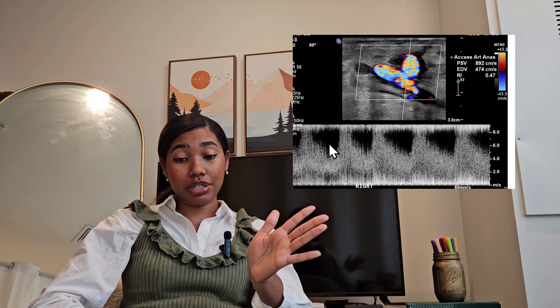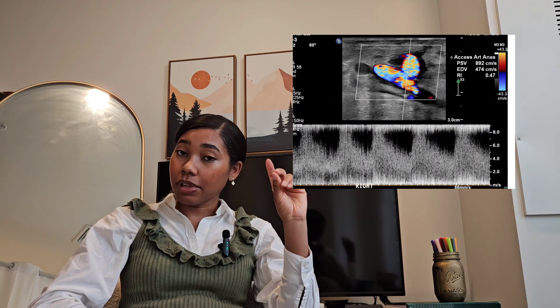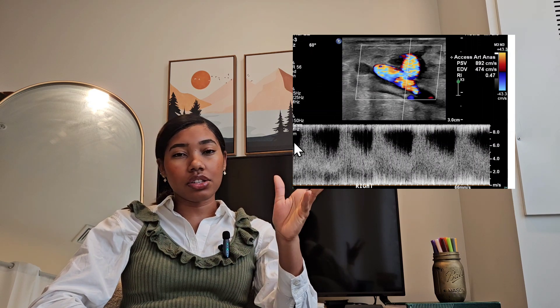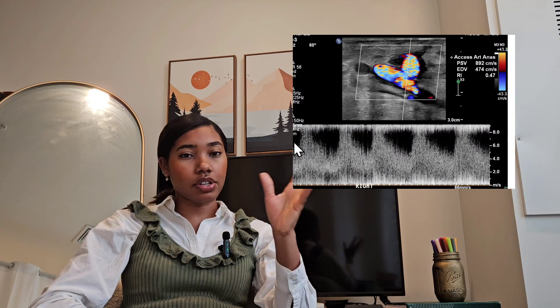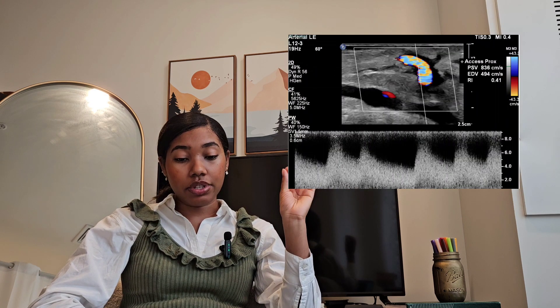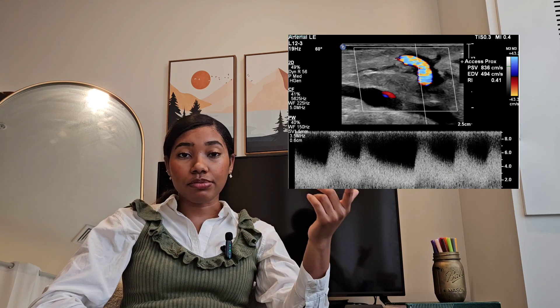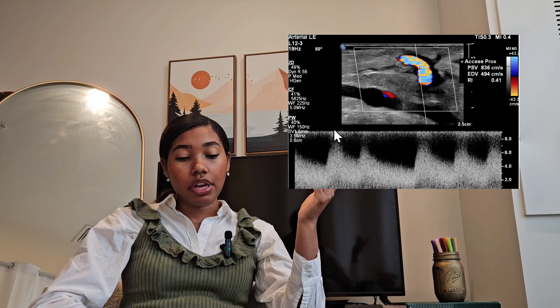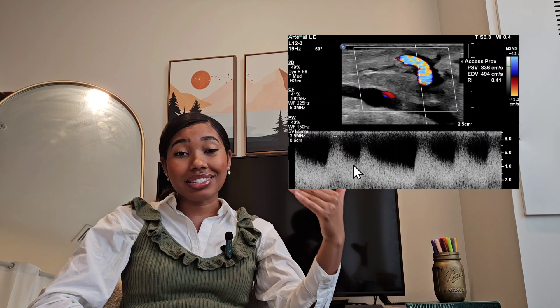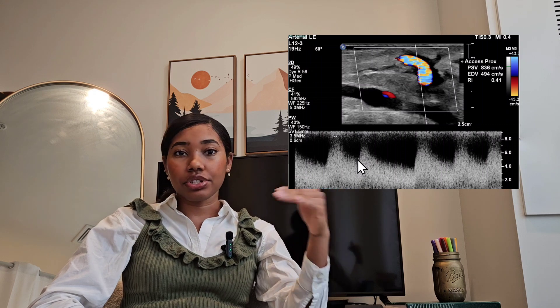As far as your color Doppler image, it's going to look crazy. You do have to play with the scale and color gain, but it's not going to look uniform — it's going to show a lot of aliasing with most fistulas. Now you move on to the proximal fistula. I took some velocities here; the high velocities are continuing in this fistula, but essentially you're just progressing and sticking with the protocol.